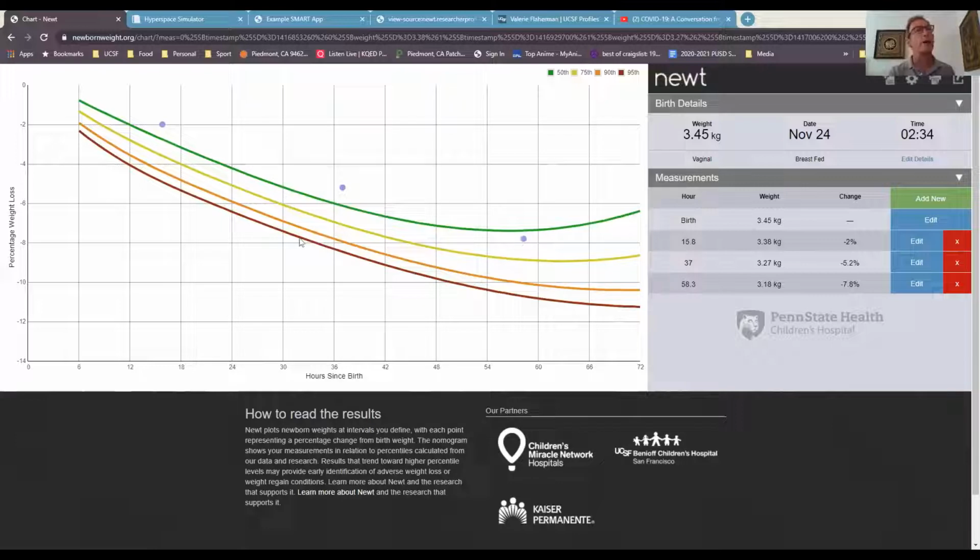That's not unusual. But the fact that they're still so close to this green line on the nomogram here lets us know that this child is still doing okay. No need to worry yet. Hopefully the next reading will start to tick up, as is normally the case.